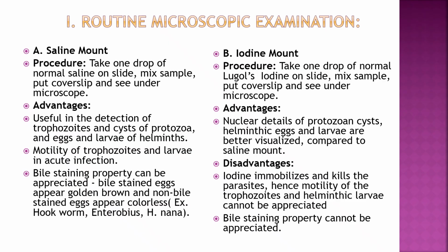Advantages: the nuclear details of the protozoan cysts, helminth eggs and larvae are better visualized. Disadvantages: iodine immobilizes and kills the parasites, so motility of the trophozoites and helminth larvae is not appreciated, and bile staining property is not appreciated.